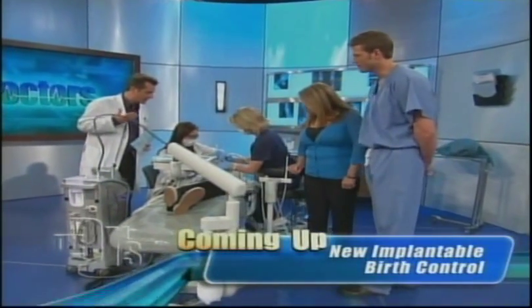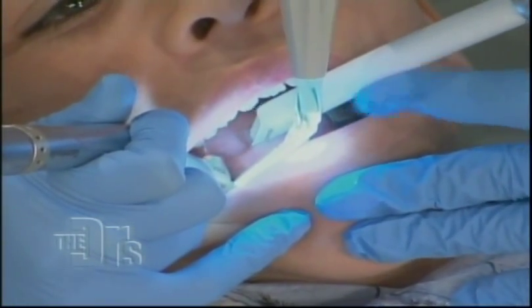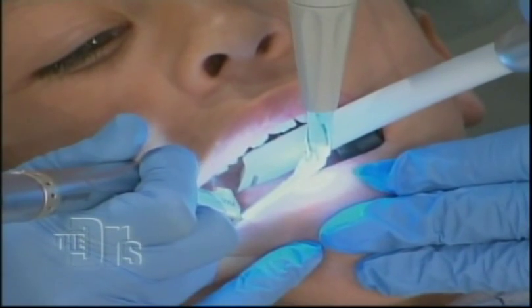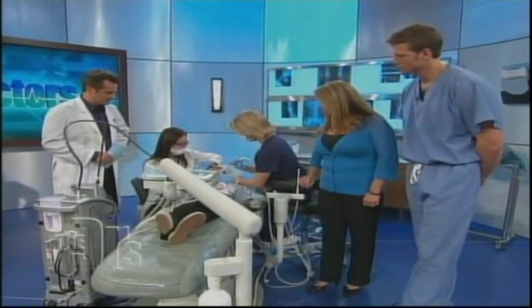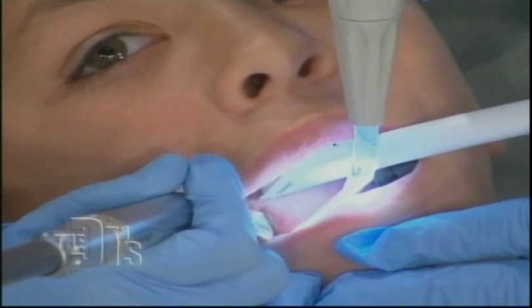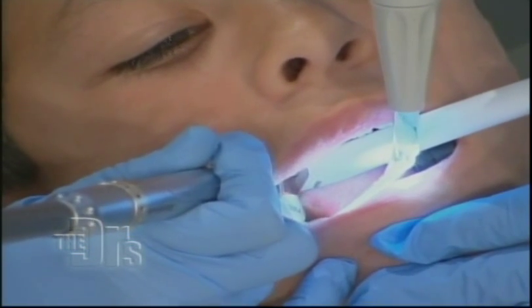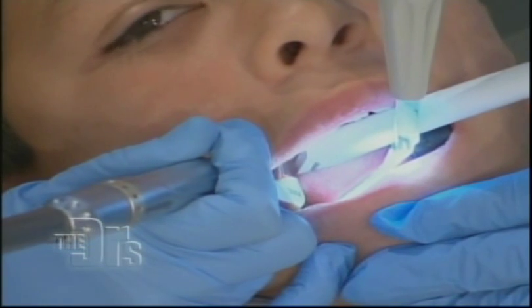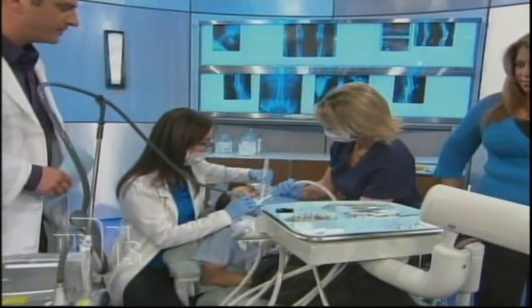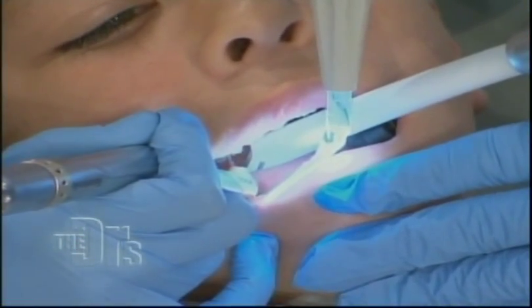Yeah, immediately we just put our patients down and get started. So Zach, I'm going to use my water gun to take out all the decay — the sugar bugs that eat your tooth. The sugar bugs, which is the plaque and bacteria on your tooth, is like a mushy type of material. Because of this, there's a lot of infection in the tooth, and eventually if you leave the decay there — which happens to a lot of patients because they're scared to come to the office — they end up needing a root canal. So this is the best and easiest way of prevention: take the decay out in its earlier stage without having to get a shot. So the laser is inside this machine and it comes out as a beam of light and breaks off the water molecule.